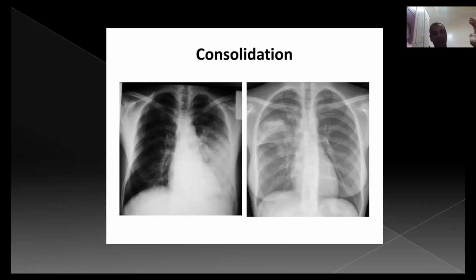Is it interstitial disease or air space disease? Air space means alveolar shadows or acinar opacifications, but interstitium means interstitial infiltrations or fibrosis or nodules in the interstitium beside the alveoli, as you know from the pathological background.